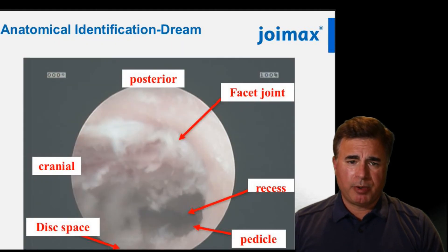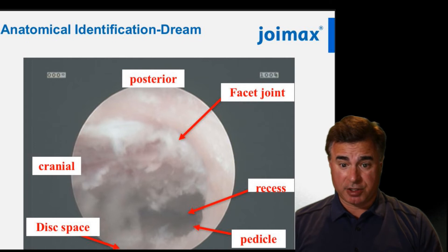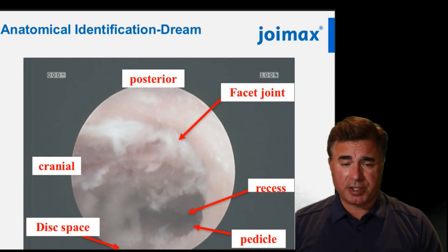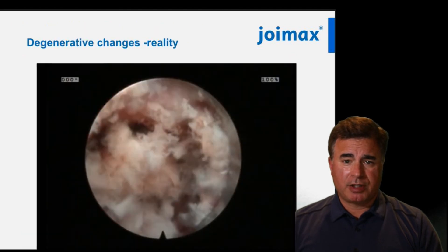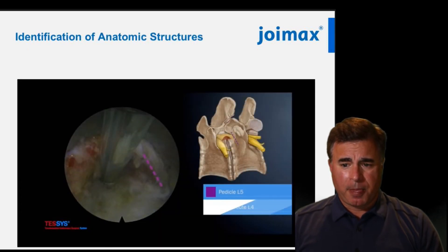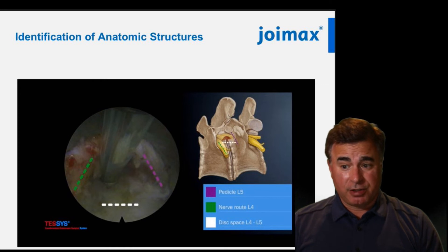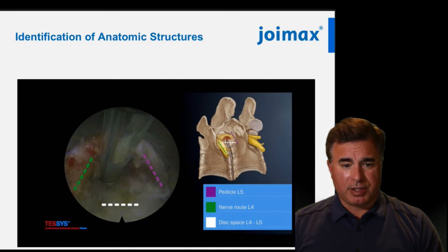Next, I like to identify bony landmarks early on so you'll always be able to tell where you are. It's easy to get lost, especially when you start off, so having something familiar such as bony landmarks is really advantageous. If you identify the pedicle and the facet joint, you know where the lateral recess is and that's where your neural structures are likely to be. When there's a lot of degeneration it's not always easy to define your anatomic structures, so I like to think of it simply: identify structures that don't move, such as the pedicle (marked here in purple), then identify structures you could injure, such as the nerve root (marked in green), and know that everything in between is disk material (marked in white).